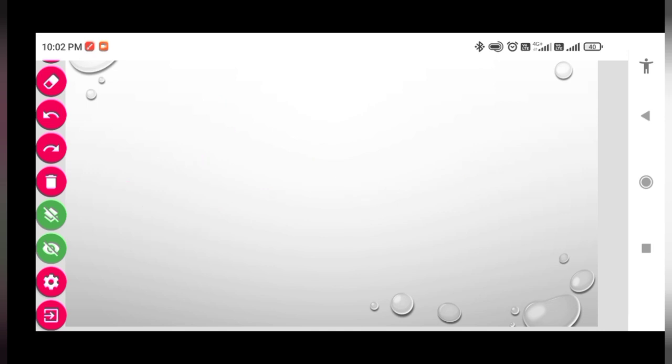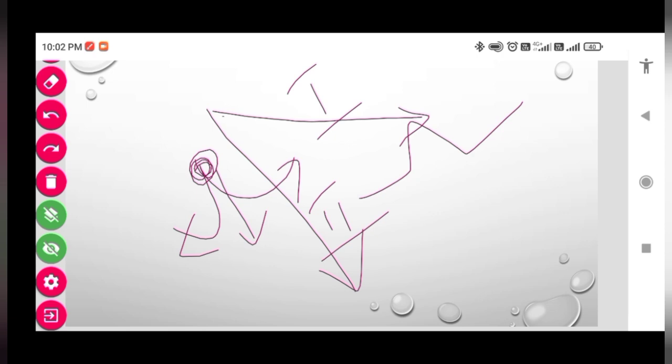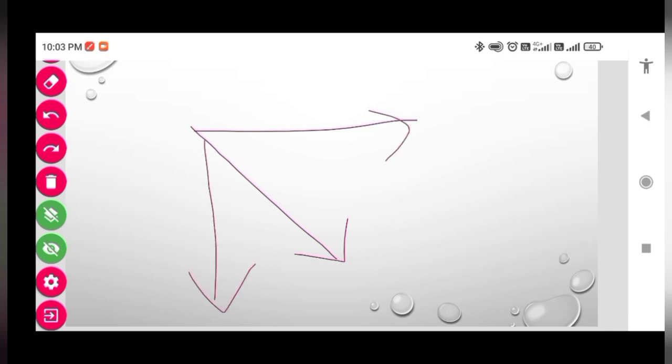So let's see this. When the impulses from the SA node get conducted to the different parts of the atrium, this is recorded as a slightly positive wave on lead 2, which is along the same direction. Okay, next coming to lead 1. When a vector is at 45 degrees, it has both a horizontal component as well as a vertical component, right?